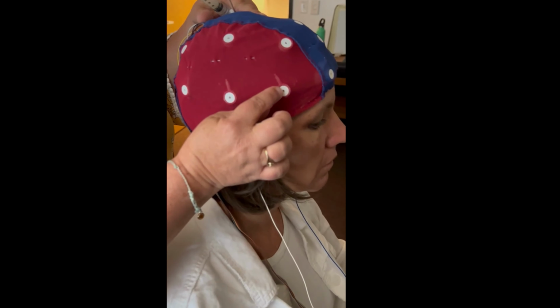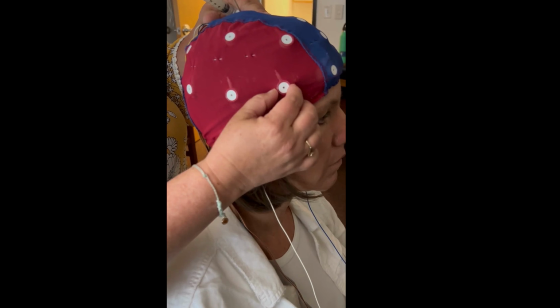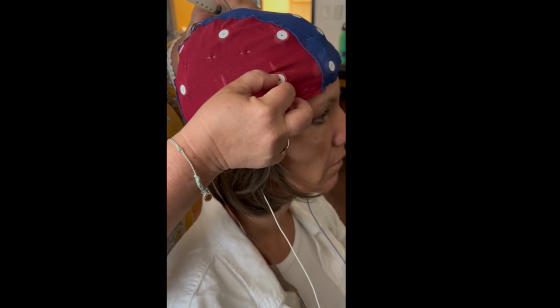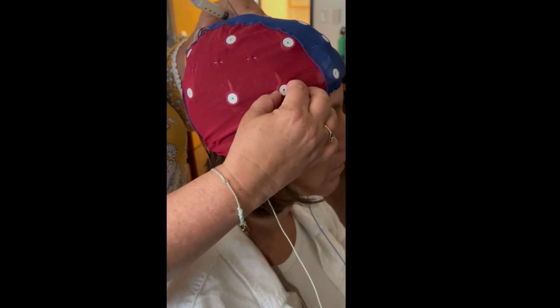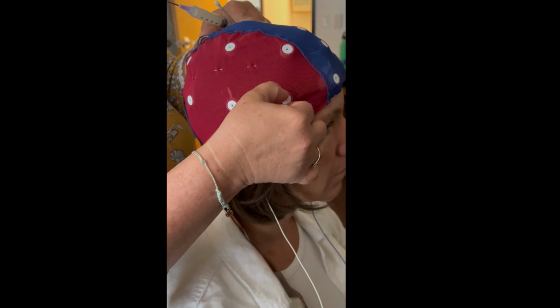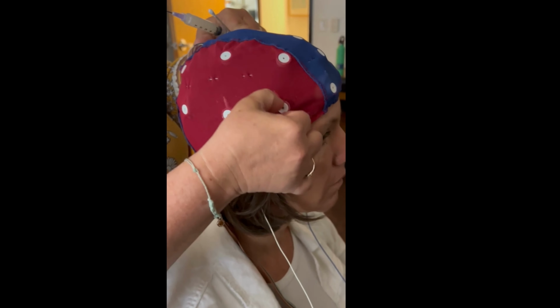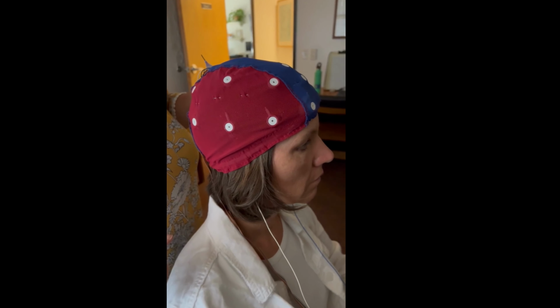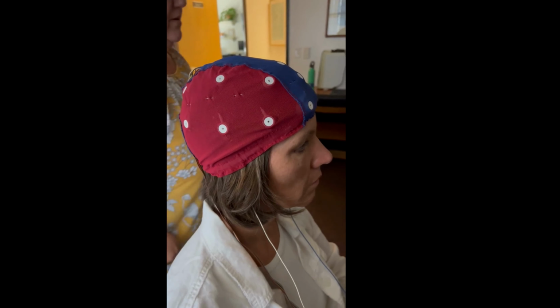the electrode. You can lift it up a little bit and just rock it a little bit back and forth like this. Give it a kind of a rocking back and forth. And then sometimes we'll do a little shake up and down like that. And then we'll take a look over here and see how we did. Okay. So we went from red to yellow, but we want to resolve the yellow to have green.